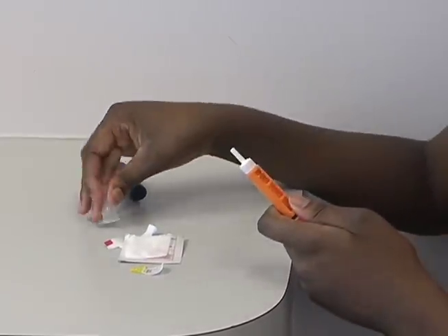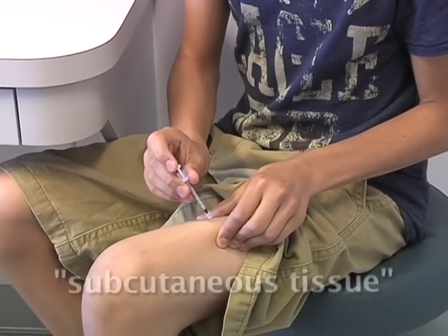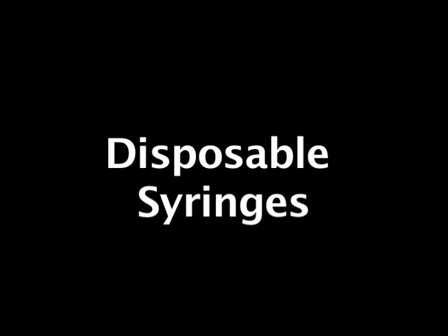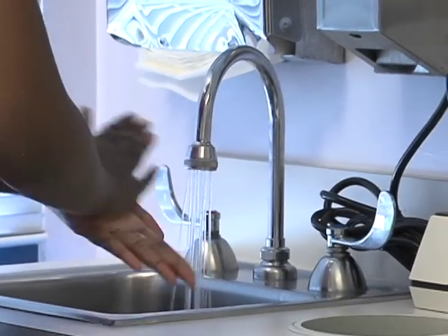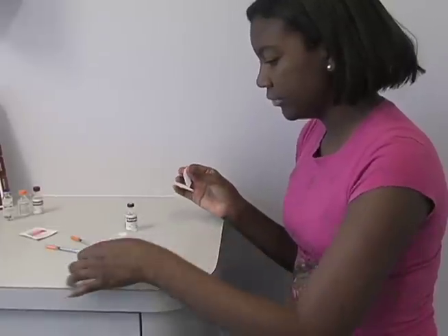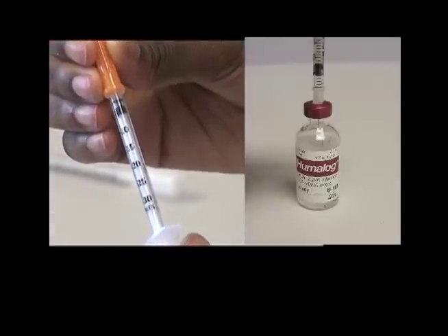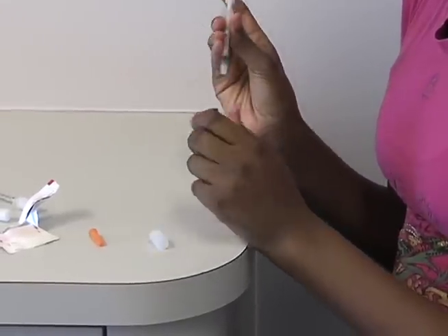These devices deliver insulin through the skin and into the fatty tissue, which is also called subcutaneous tissue. Here's how to get started using disposable syringes. Before any injection, always wash your hands with soap and water and dry thoroughly. Clean the top of the insulin vial with alcohol. Pull the plunger of the syringe to the number of units of insulin you need and inject the air into the insulin vial.